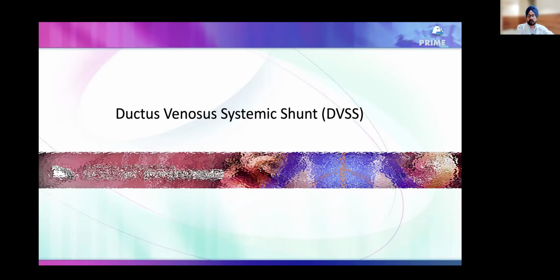And if you talk about the superior vena cava, that should be the largest vessel. The basic reason is not the area which it is draining. The quantity of cardiac output going to the brain is far higher than going elsewhere. So that's why the superior vena cava is generally larger than the inferior vena cava, or the same size.